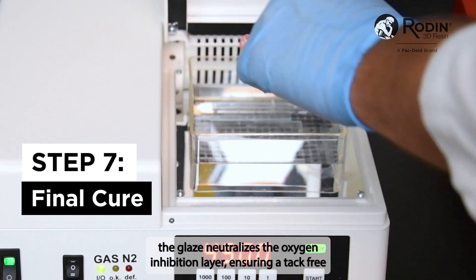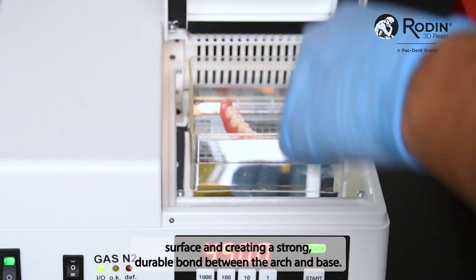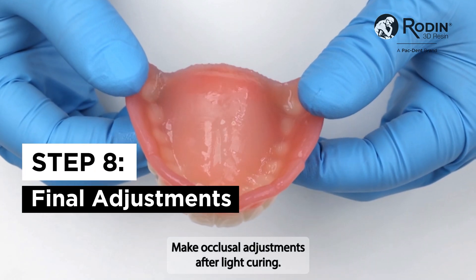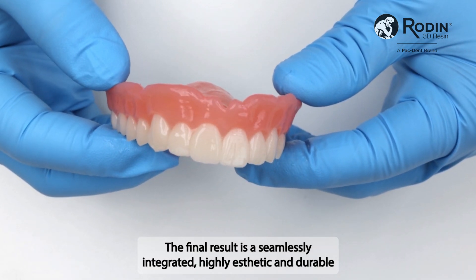During light curing, the glaze neutralizes the oxygen inhibition layer, ensuring a tack-free surface and creating a strong, durable bond between the arch and base. Make occlusal adjustments after light curing. The final result is a seamlessly integrated, highly aesthetic, and durable printed digital denture.